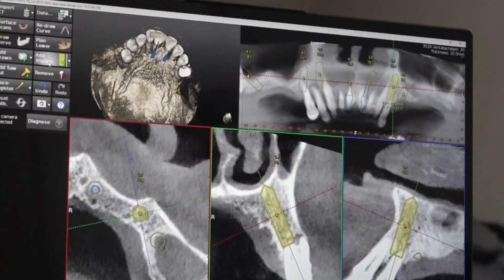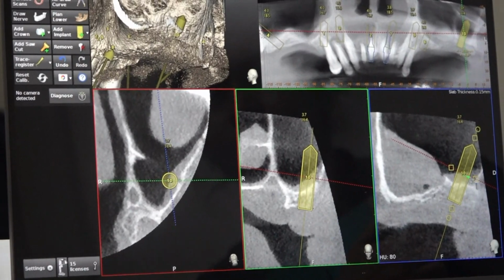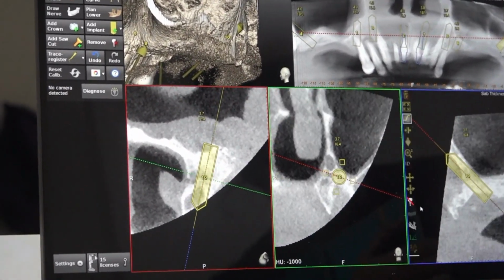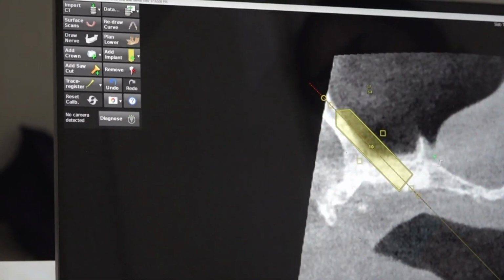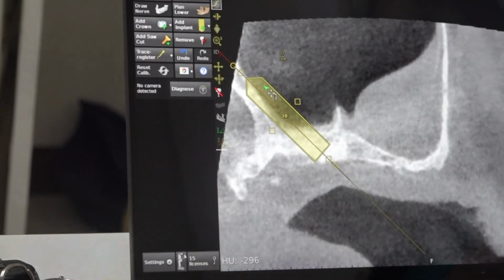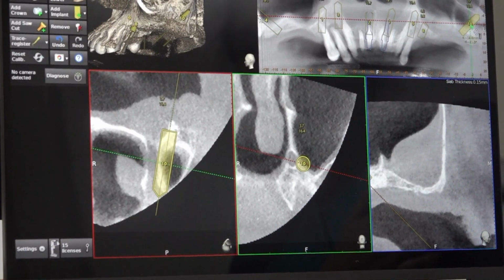Otherwise, we have to give pterygoid. You will see the sinus area; the sinus area is not good. Okay, full sinus intrusion we have to give to reach the pterygoid. The pterygoid doesn't come fully, right? Even here the sinus is expanded. You can see the sinus is expanded till here. So the pterygoid will be challenging. So we try to place the implant in this manner without pterygoid.